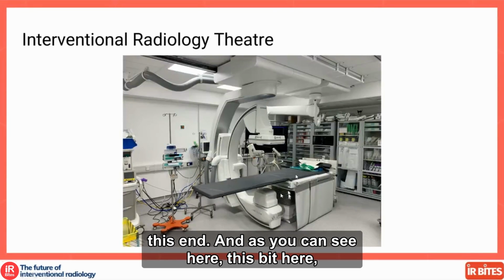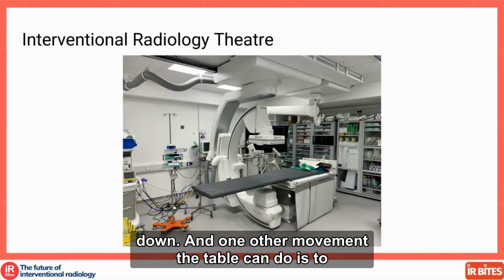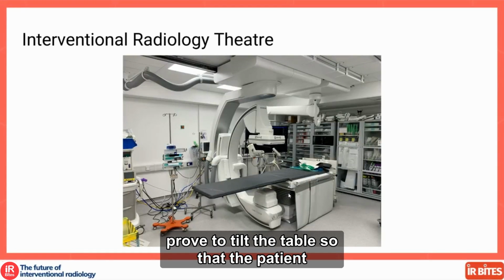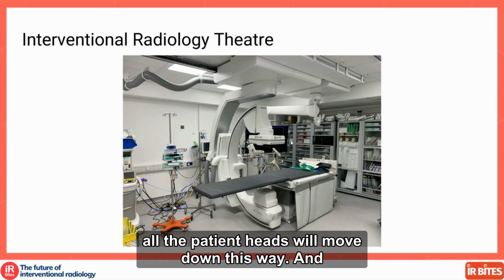As you can see, this bit here will allow the table to be moved up or down. And one other movement the table can do is to tilt, so that the patient's head moves up this way, or the patient's head moves down this way.